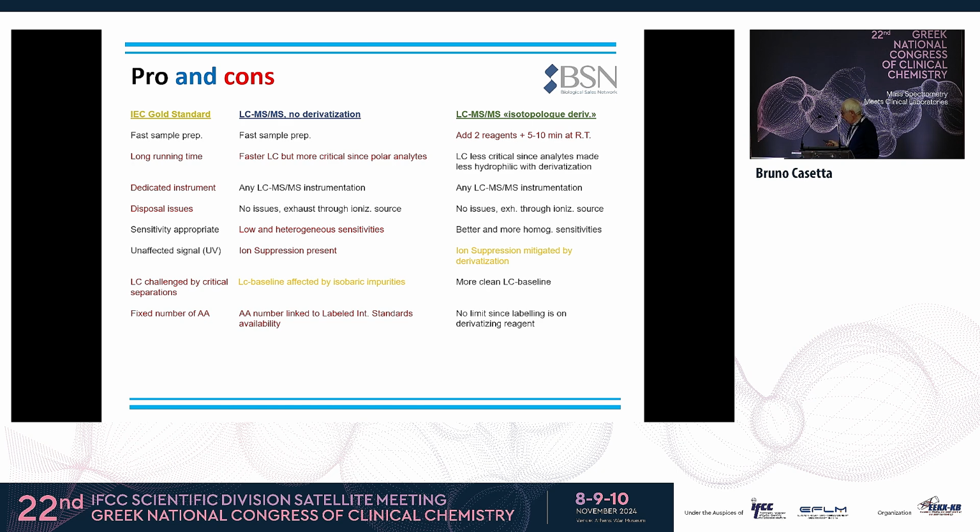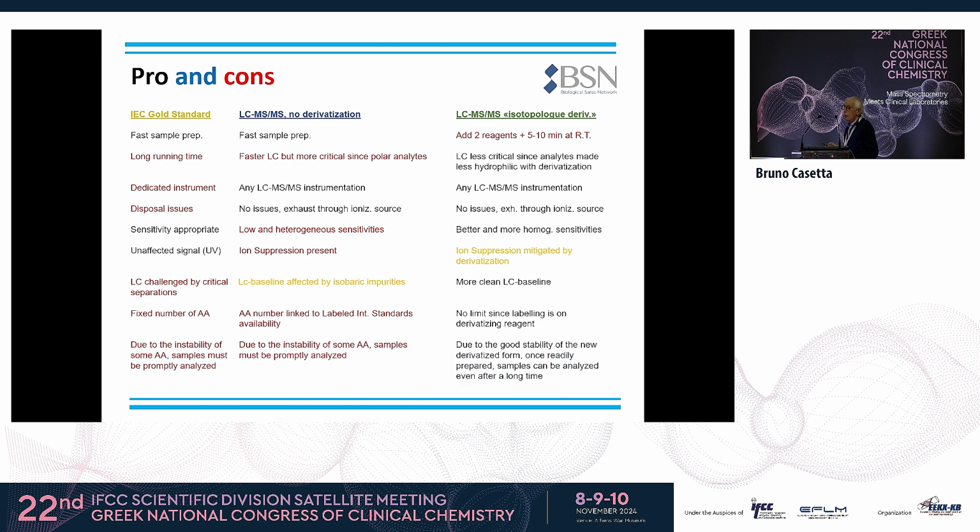Last but not least, and this is something which surprised myself as well when we started to develop it: in these two cases where we are handling the native amino acid, we must be careful in doing the analysis close to the specimen collection. Otherwise, we have instability affecting several amino acids.